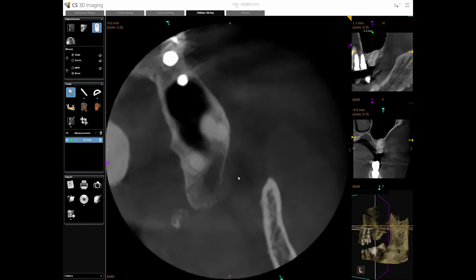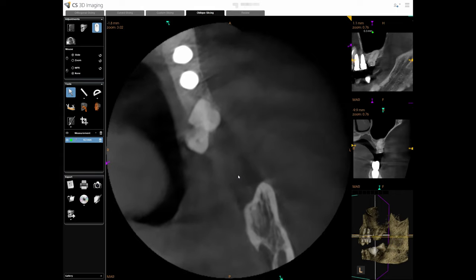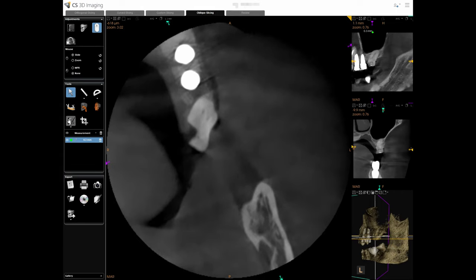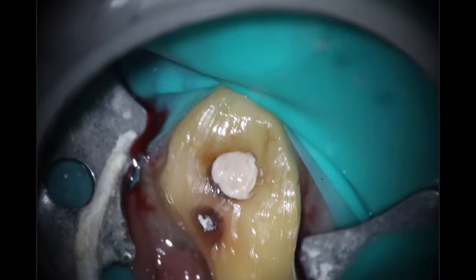So I knew this was going to be a fun one. I got some lengths, knew that there was really only one MB, so I wasn't too worried about the complexity of that part of it — but wait until you see how we handled this one. Here's what the tooth looks like. As you can see, it's definitely rotated there. Ended up using a 2A clamp for this — the 14 wasn't going to be anywhere close to it.